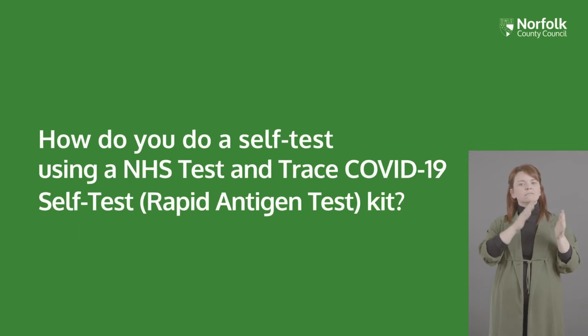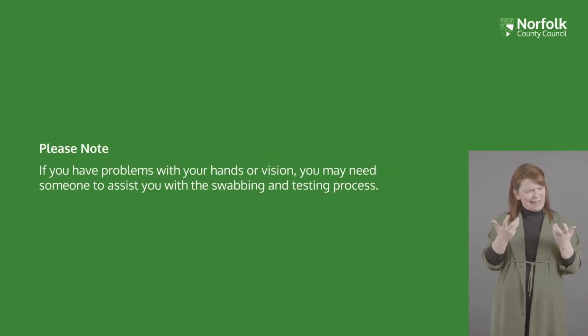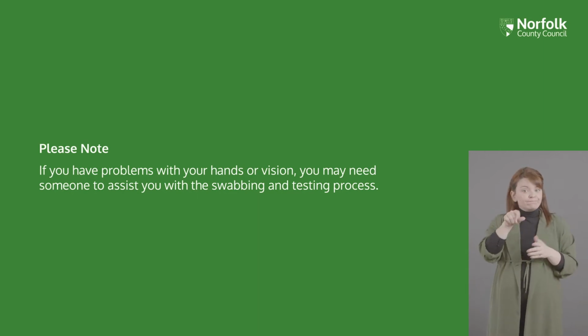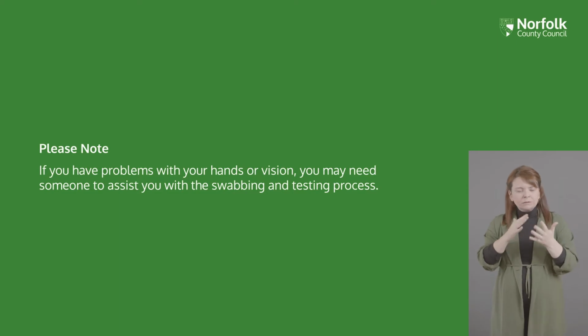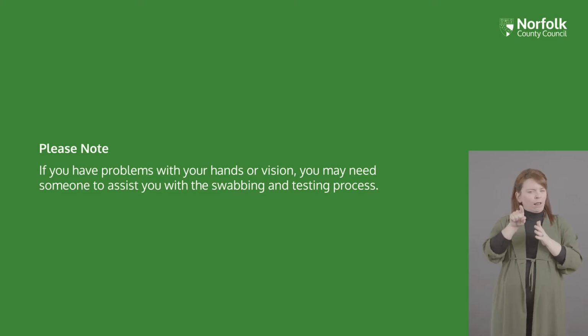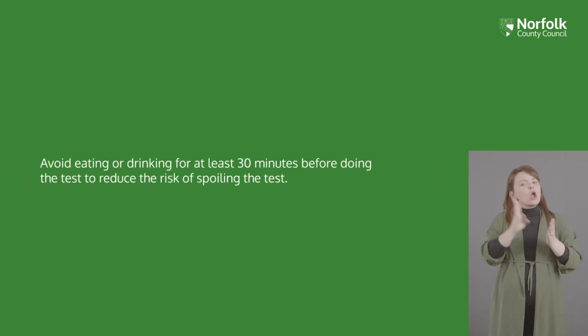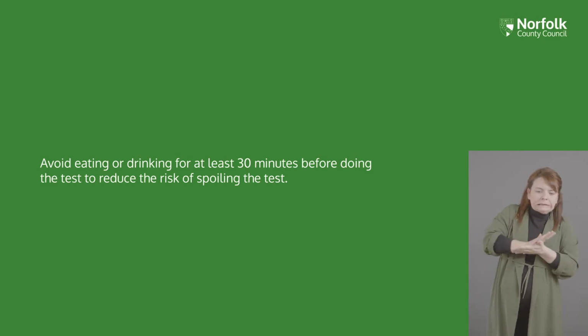How do you do a self-test using an NHS Test and Trace COVID-19 self-test rapid antigen test kit? Please note, if you have problems with your hands or vision, you may need someone to assist you with the swabbing and testing process. Avoid eating or drinking for at least 30 minutes before doing the test to reduce the risk of spoiling the test.